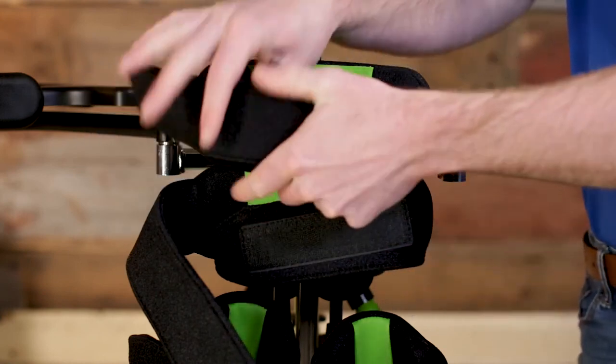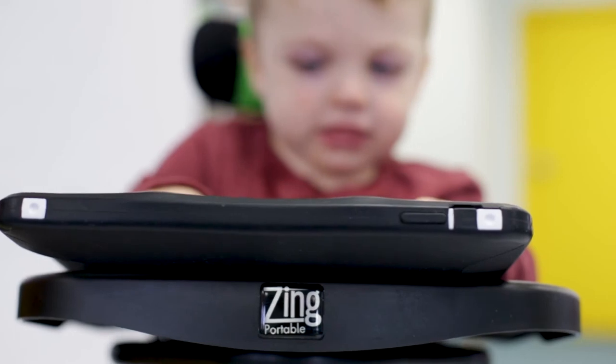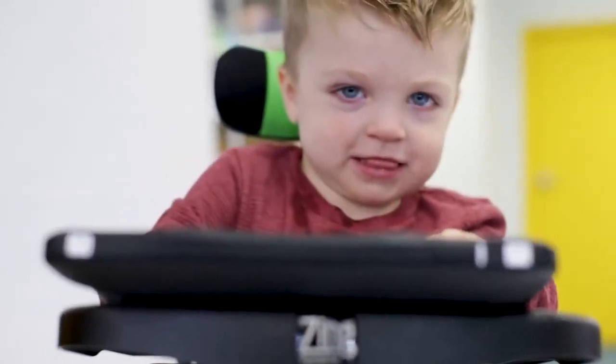For more information about the Zing Portable and to learn more about all the Zing products, visit zingstanders.com.